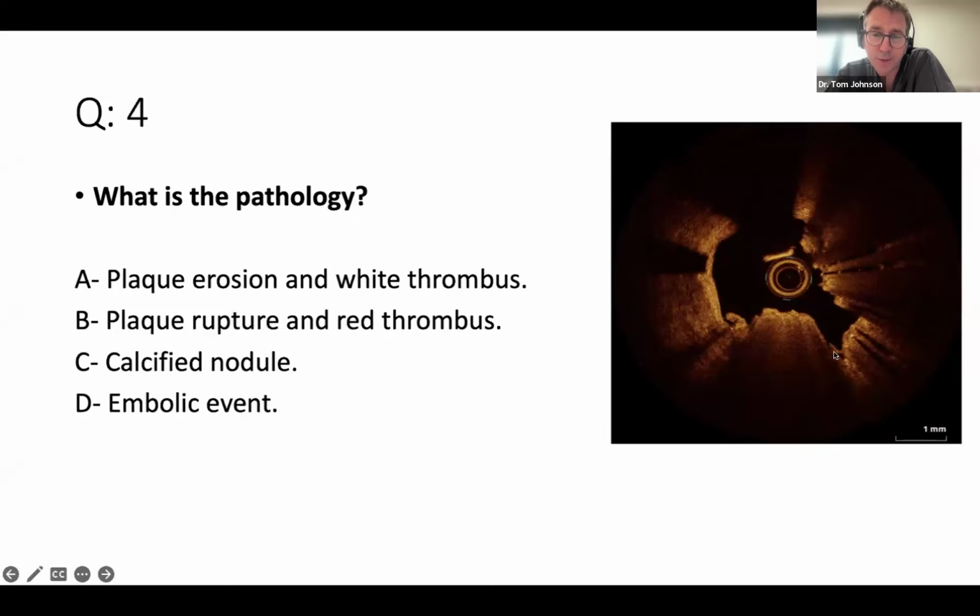It's more classical of an eruptive calcified nodule, just by virtue of the way that this often looks in terms of its pattern. When you come into that gap between these 2 protruding nodules, there might even be stent struts. Within the tissue, there are 2 linear streaks, again heading in a straight line from the center of the catheter probe out to the boundary of the image. Whether that's a strut or something that equally has high reflectance. And also at 4 o'clock, you see those 2 slightly smaller profile.